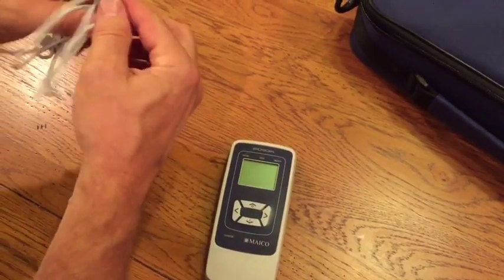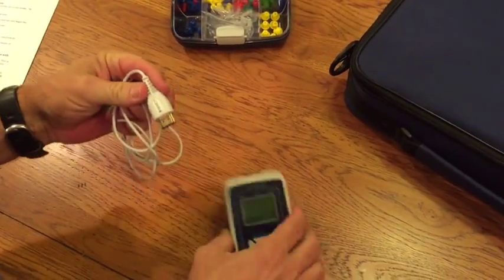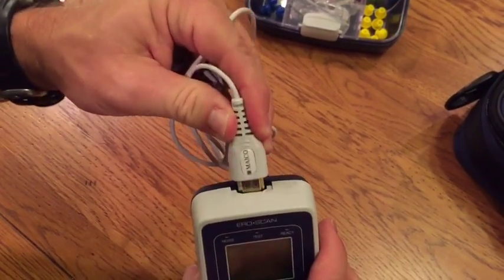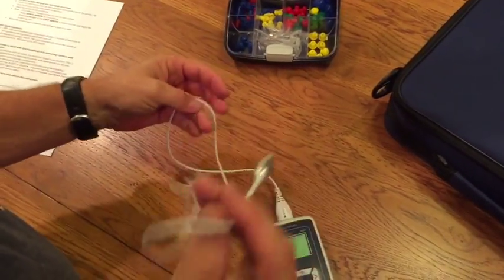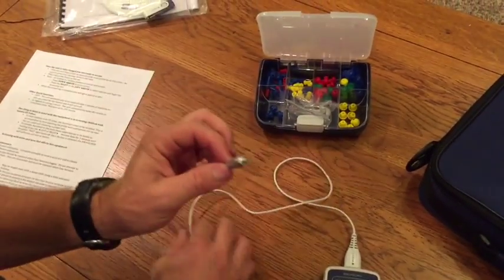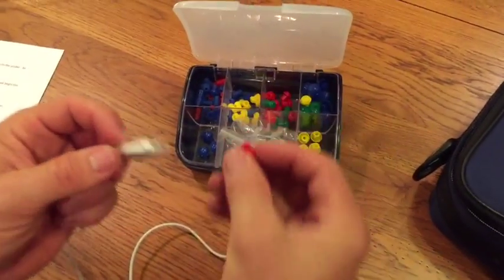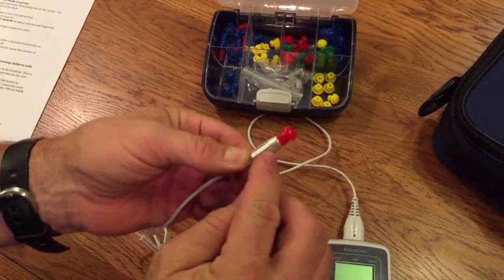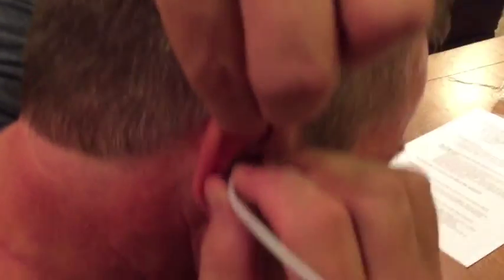Now attach the probe assembly — orient it with the name on top and plug it directly into the top of the unit. You're now ready to test. Pick an appropriate size probe tip and push it all the way down to the base so that it is fully flush. Then insert the probe into the ear.